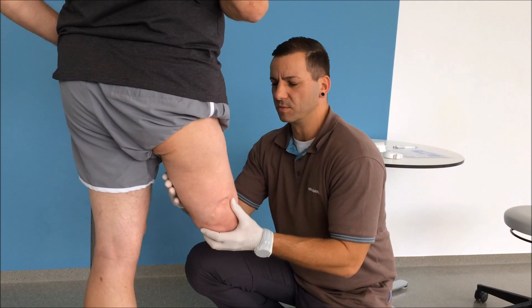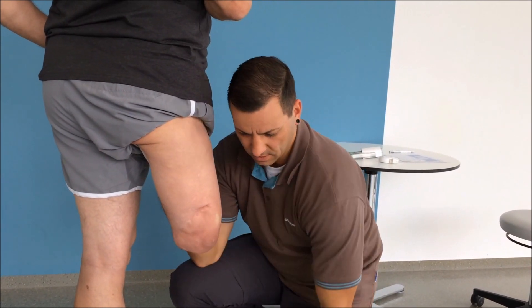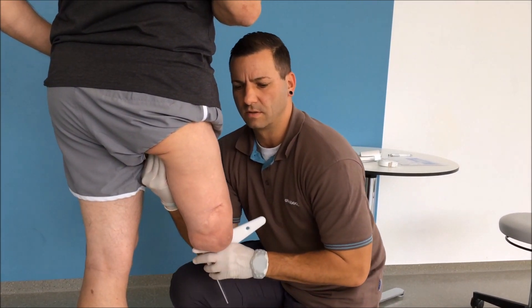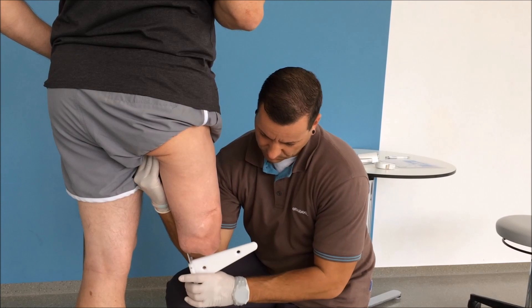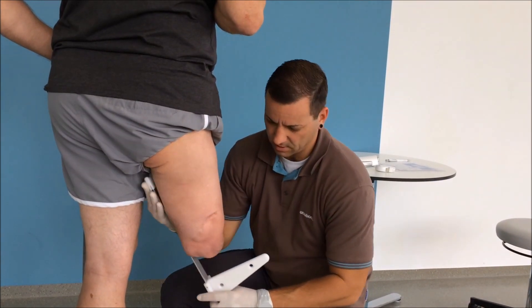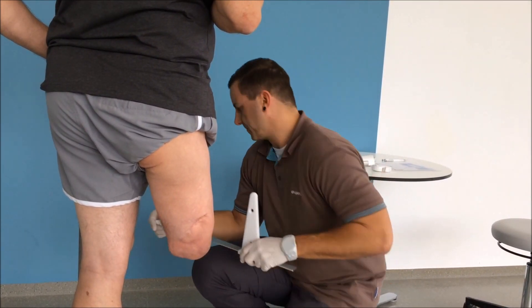I start by measuring the length and I use the 743 S10 calipers for this. I determine the length by finding the ischial tuberosity, then sliding the calipers underneath and asking the user whether I'm in the right spot. When the patient's muscles are relaxed I apply a bit of pressure as I guide the calipers under the end of the residual limb, read the measurement and note it on the measurement form.